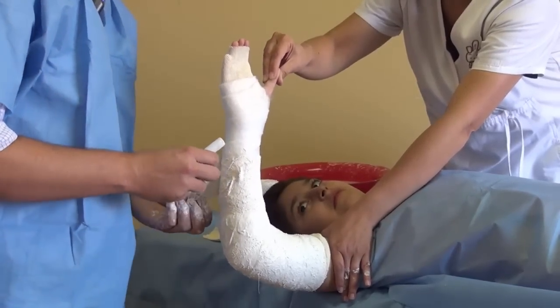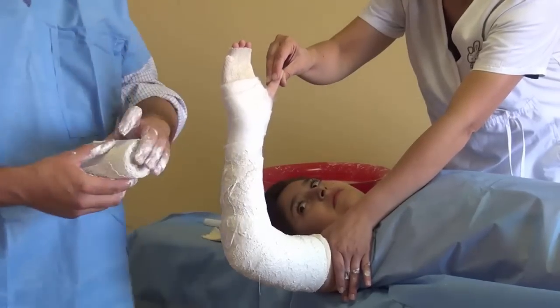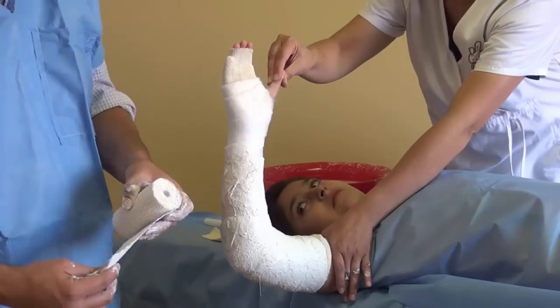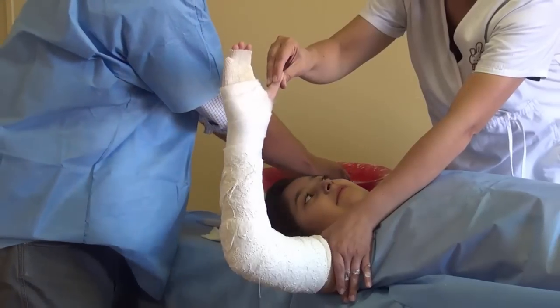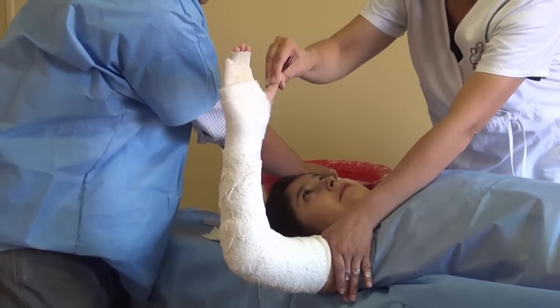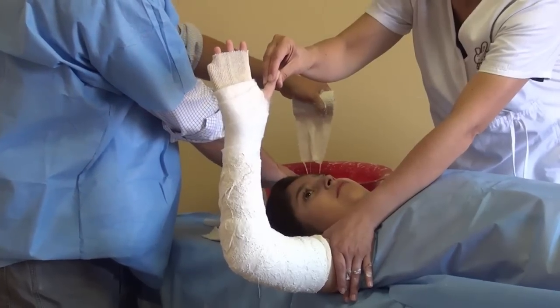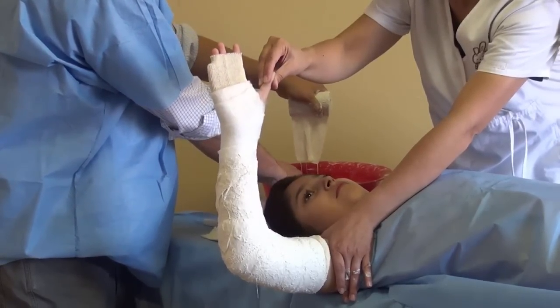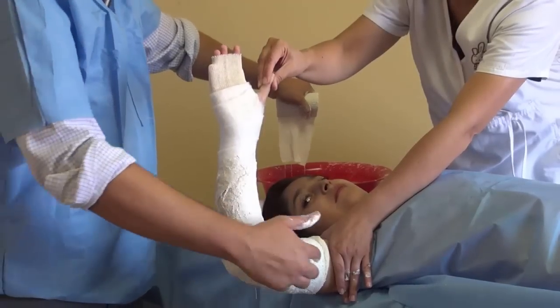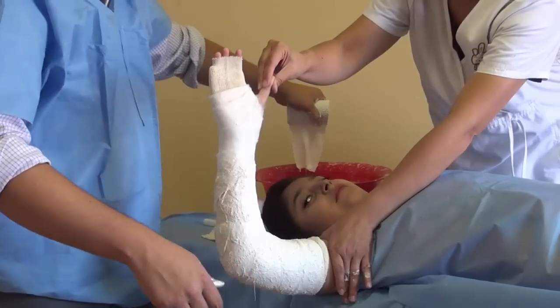This is our first cast. For the second one, same thing: unroll it about 10 centimeters first, then get it wet until no bubbles are coming out. Let it drain. And since we already did the elbow, we're just going to go straight down to the wrist and back.